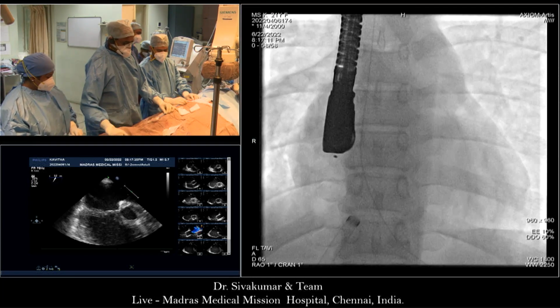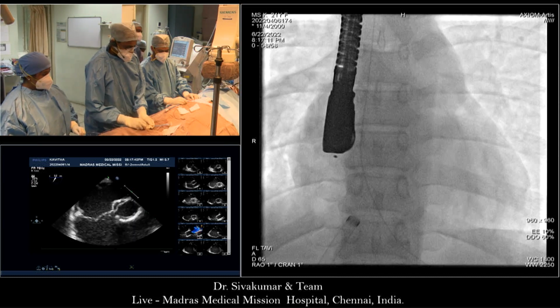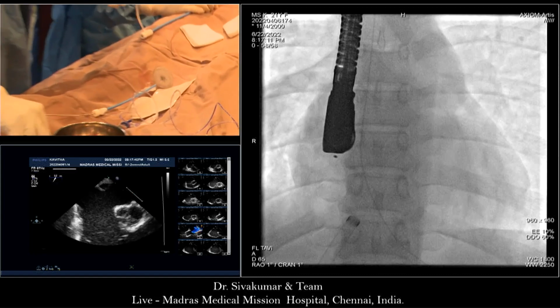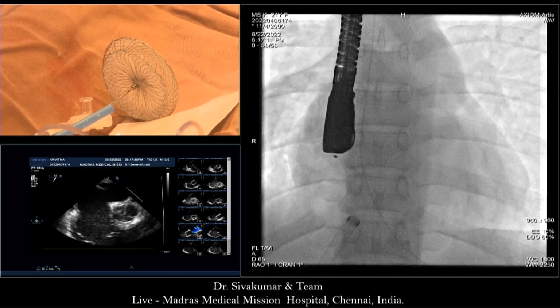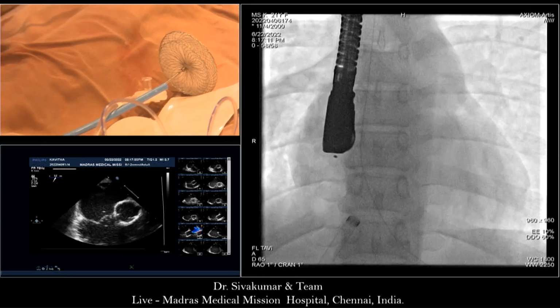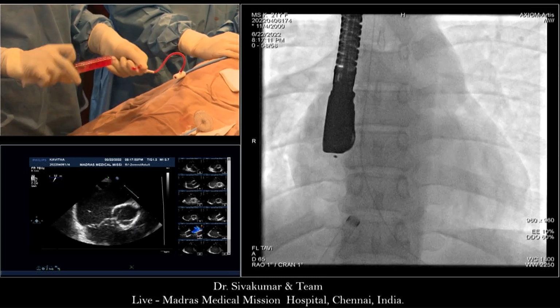Alright, if this continues to protrude, would you recommend any other technique to use? We would do it prophylactic. Prophylactic? We'll not try any other technique. No, I think he's asking about pulmonary vein deployment. Which technique would you use if it continues to protrude? I would do a balloon. Balloon assisted technique? Who described that as prophylactic? Prophylactic means from the beginning, you put another wire.